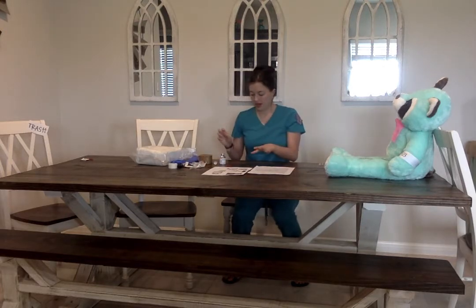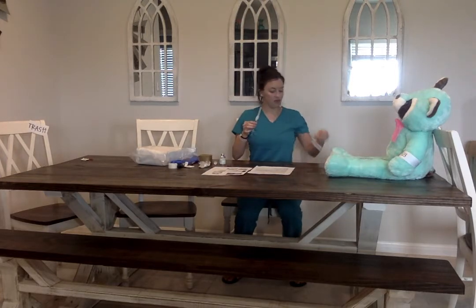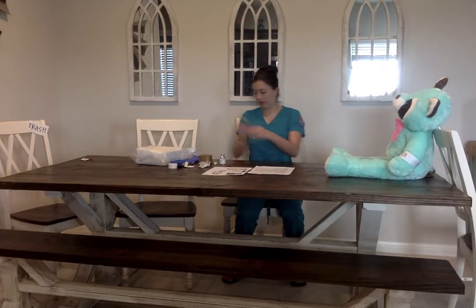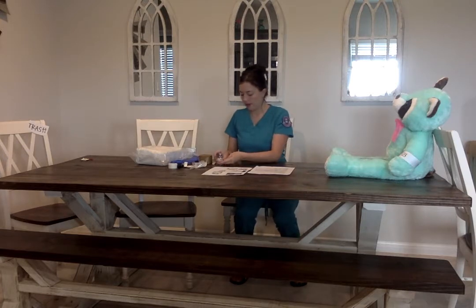I'm also going to label, and I'm keeping it at the bottom so I can still see everything. Protecting the plunger. Alrighty. So now that I have done that, I am ready to enter the room.